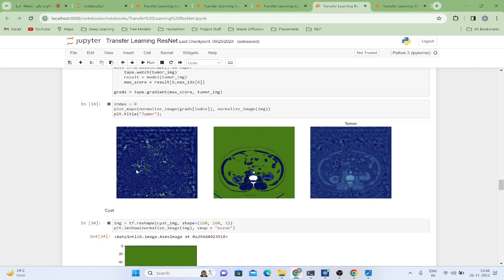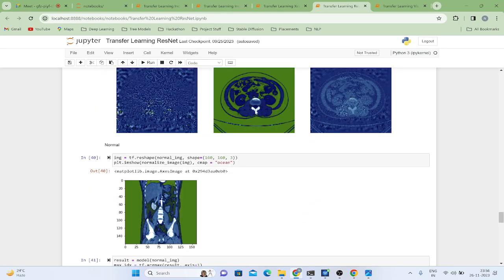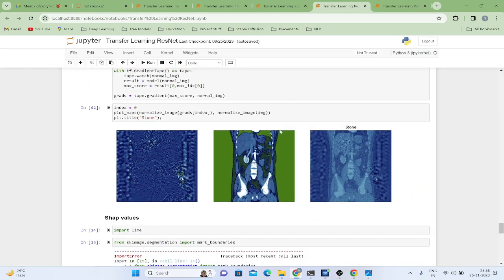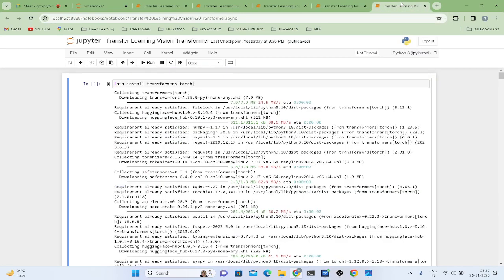They are not straight or clean saliency maps. They are not well fit, and they are not particularly pointing at the tumor where it is meant to be pointed. So although ResNet has a higher accuracy, when we look into the saliency maps, we cannot say with certainty that the model is predicting right or how it is supposed to predict. That's what we wanted to show.